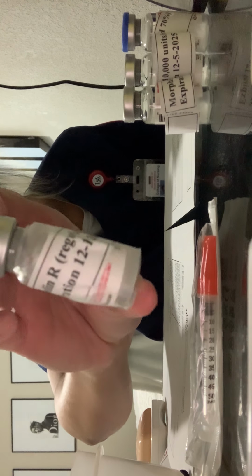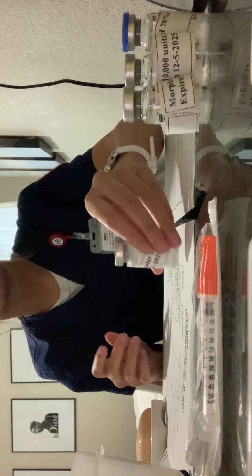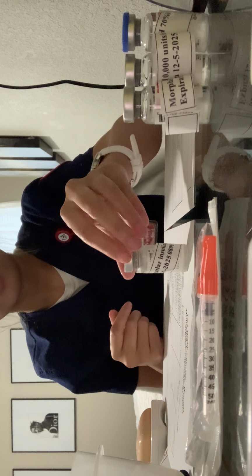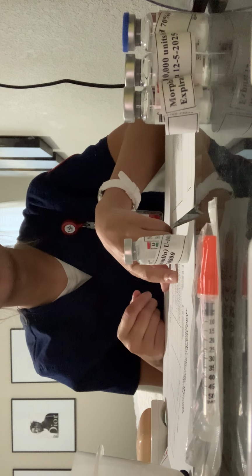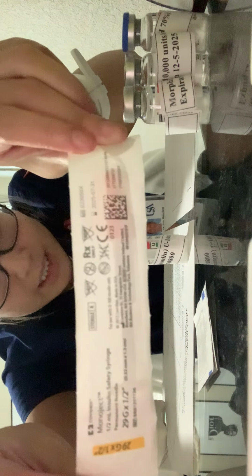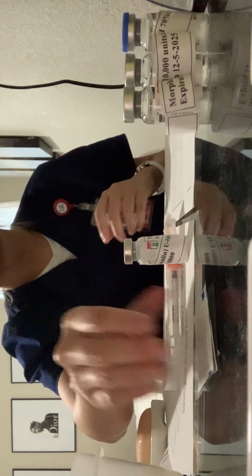So, Novolin-R. And the right dose is 10 units. The right route is subcutaneously, and I have my 1/2 milliliter insulin safety syringe right here, and the right time, which is 30 minutes before meals, and it's 30 minutes before lunch right now.